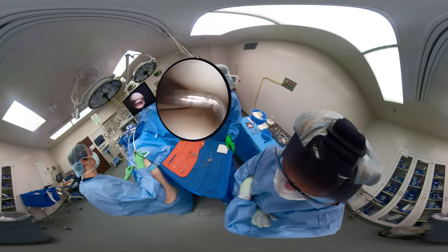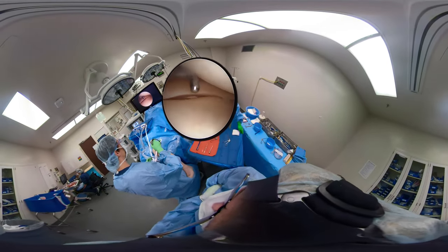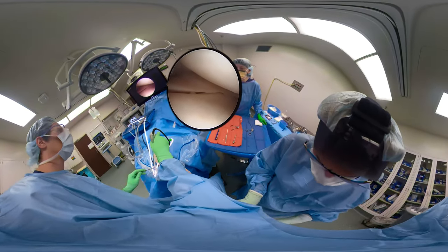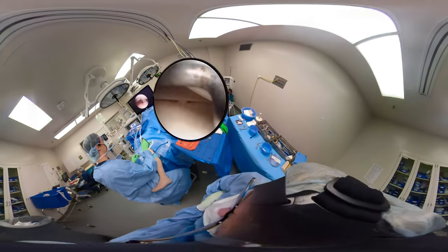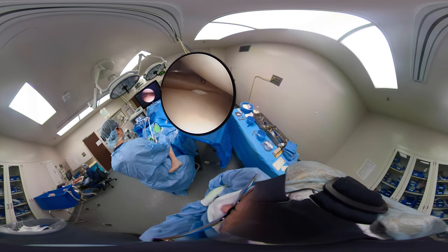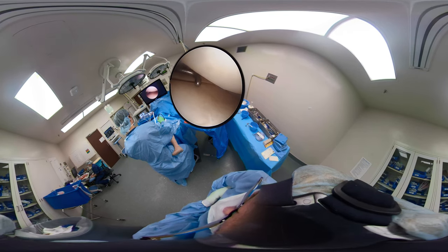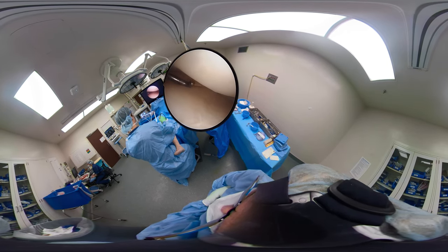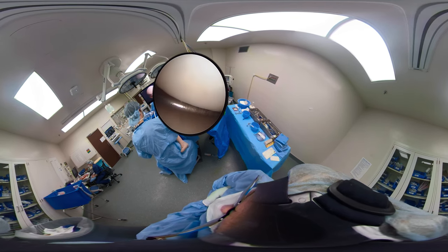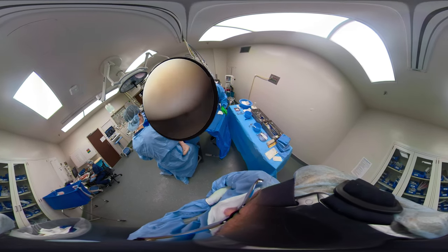Now we have our probe in the medial portal that we just established. You can see there's a little something maybe flipped under the meniscus there. The joint isn't well open so we need to apply more valgus to be able to open up that joint so we don't do damage to his articular cartilage. There is a learning curve of how much valgus to apply. Gently put a little more valgus so you can open them up, enabling you to do the work on the torn medial meniscus.